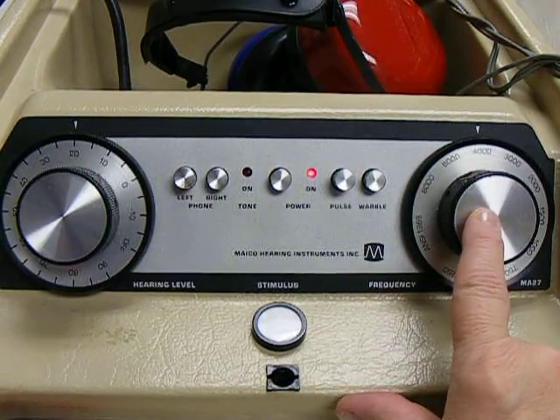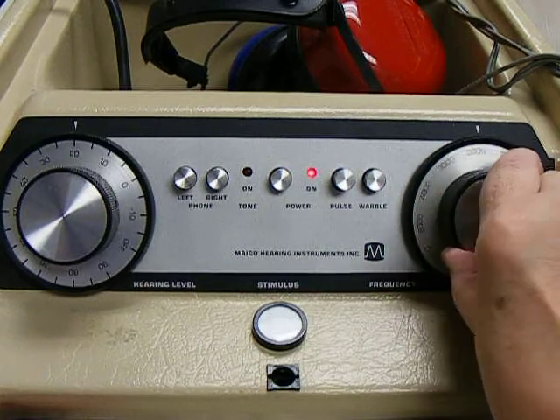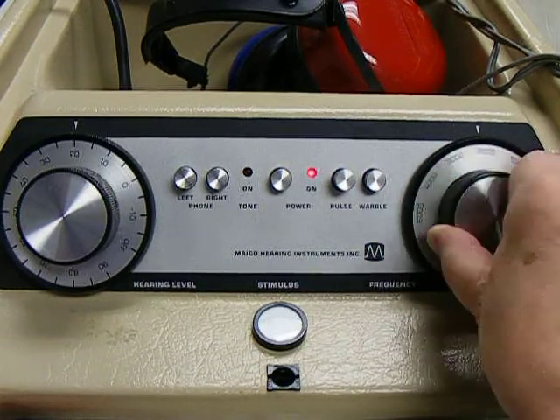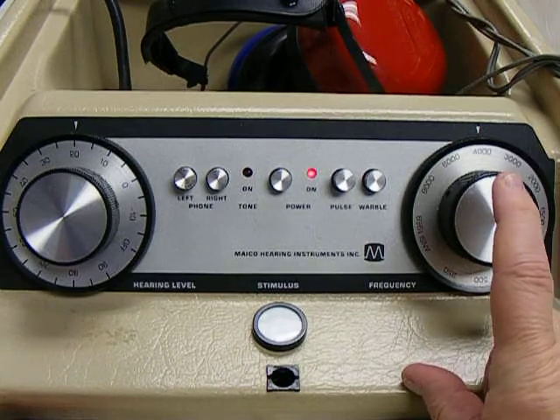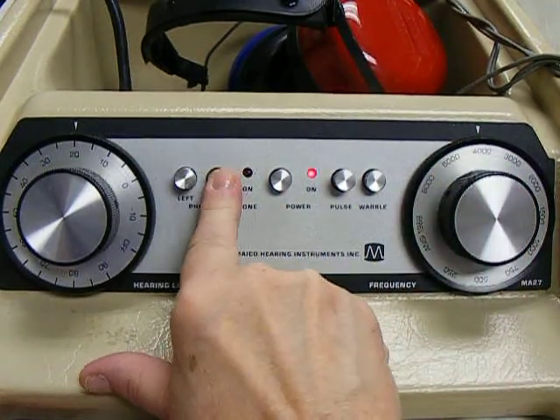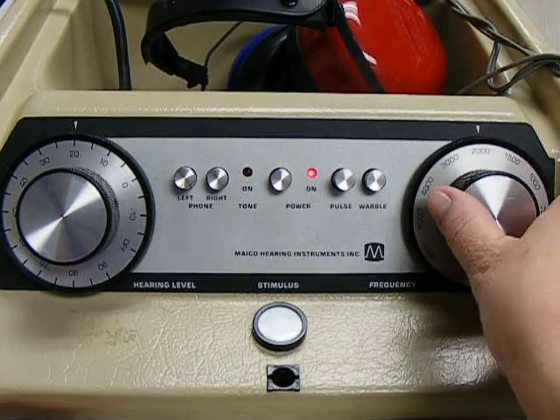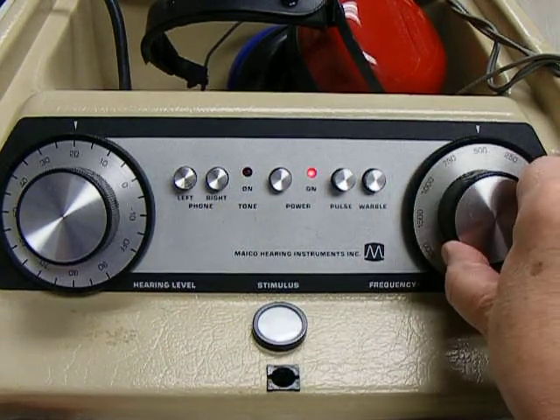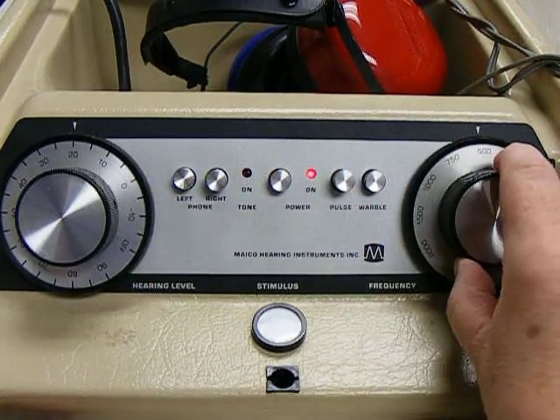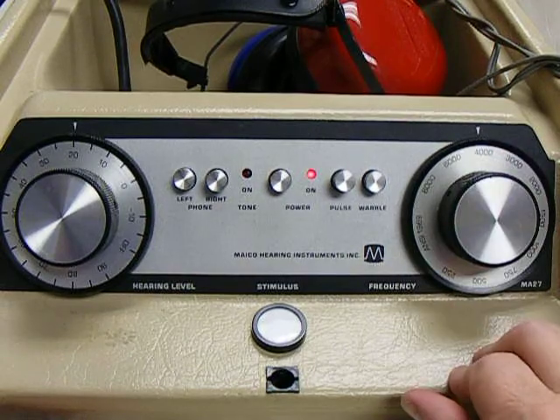This knob controls the frequency or the pitch of the tone. We go from high tones to low tones. For an elementary student, you would present at — in the right ear, always start in the right — 4,000, 2,000, 1,000, 500, then switch ears and present 500, 1,000, 2,000, and 4,000.